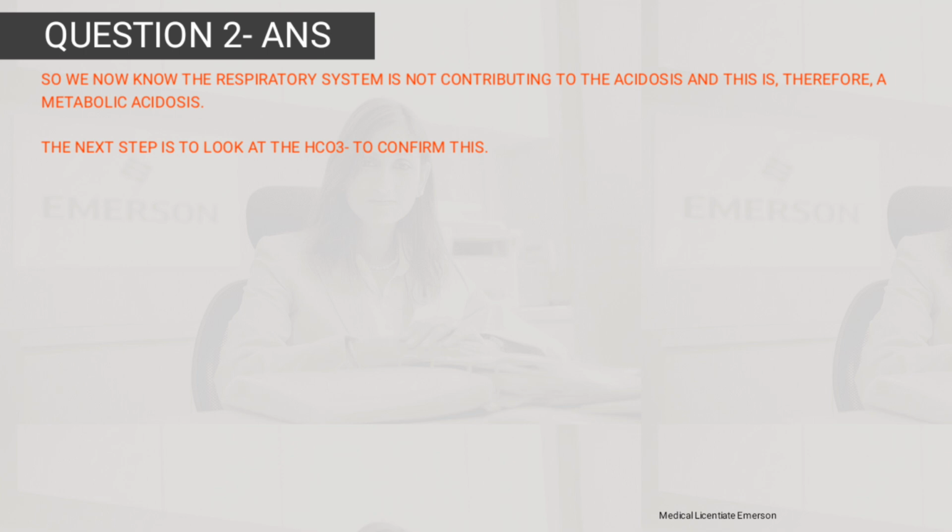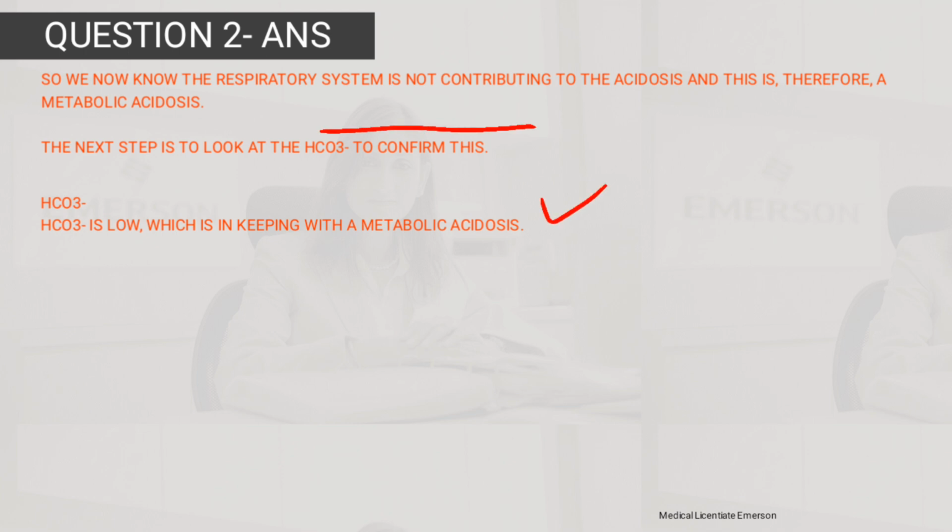So the next step is to look at the bicarbonate. So we need to confirm that what we have said, that this is a metabolic acidosis, is actually true. Okay, so you look at the bicarbonate. So the bicarbonate is low, which is in keeping with the metabolic acidosis.